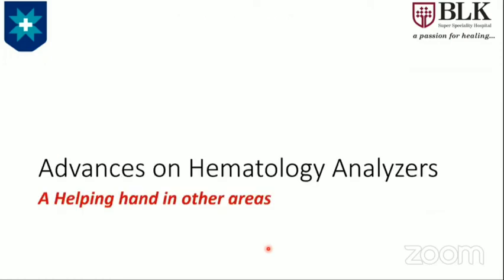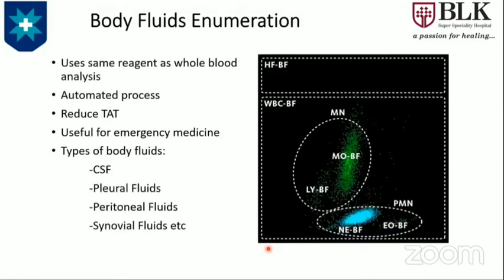Now, advances in hematology analyzers are providing a helping hand in other areas. Just to show you, body fluid enumeration is something which is always a difficult task, especially when you have to charge the chamber and you really are in a difficult state to actually look at them.